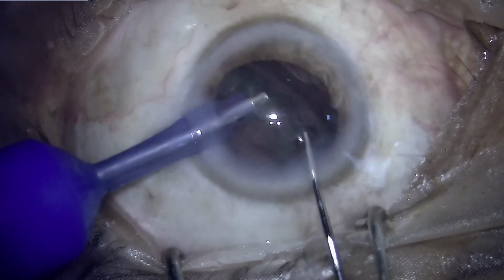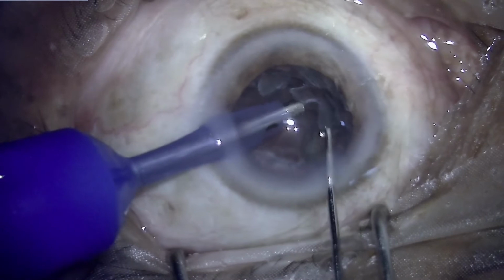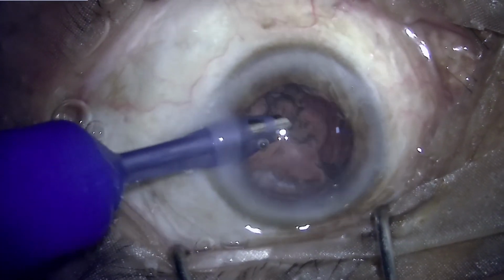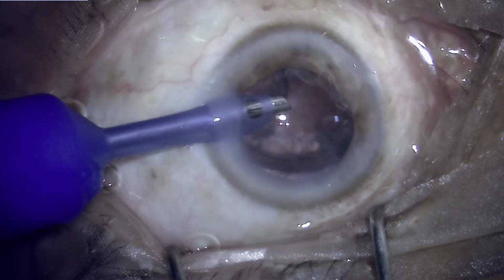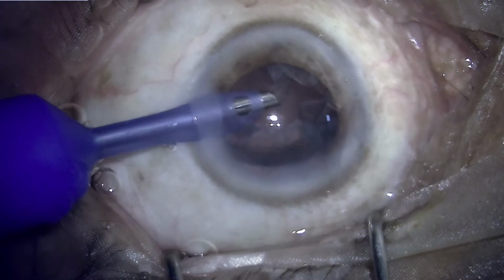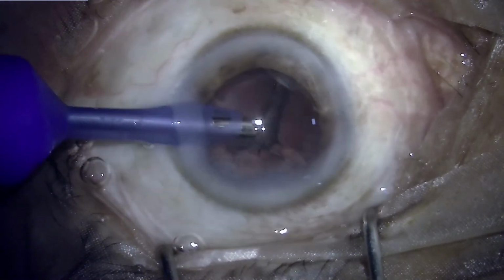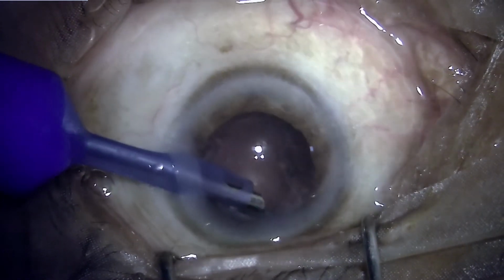Keeping the bevel down, the surgery is proceeding, and we can see it's a thin plate. It was very vulnerable to a full thickness defect if the conventional technique had been used, and this is how the occlusion can be achieved without using phaco power. Once that portion of the nuclear plate is out of the bag, phaco power can be applied to consume it. So this was a partial modification in the technique which worked for this particular case with a soft and mushy nucleus: getting hold of the remaining portion of the nuclear plate, applying just aspiration, and then switching to phaco power once the nuclear plate is out of the bag.